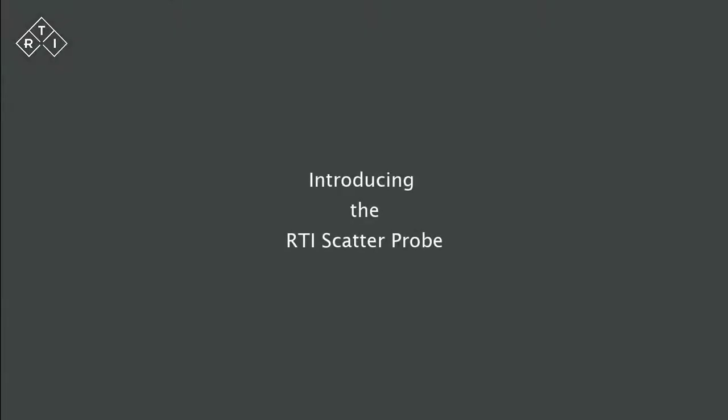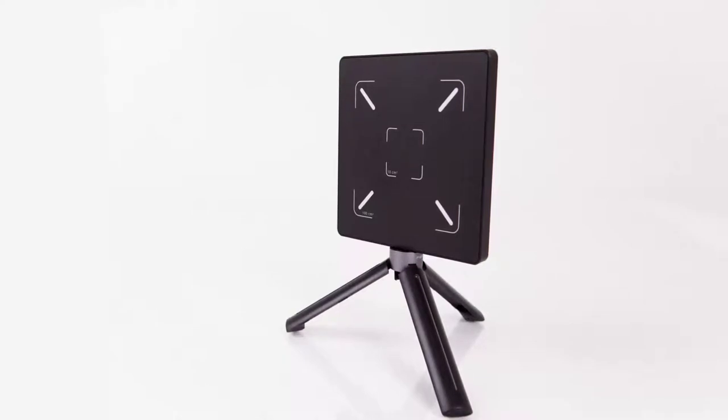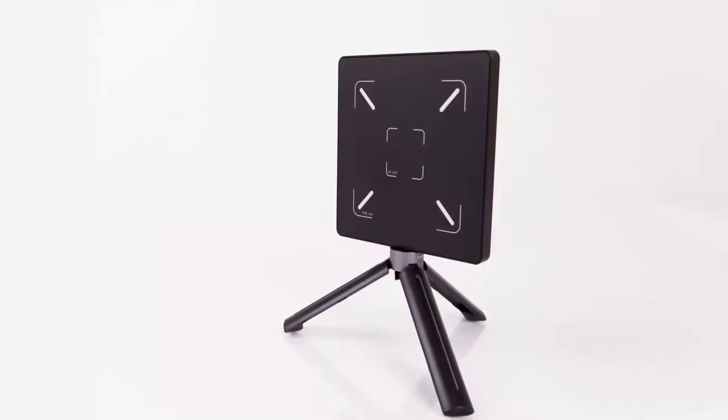Welcome to this introduction to the RTI Scatter Probe. During this presentation, we will make you familiar with the RTI Scatter Probe and look at the most common areas of application, the measurement of X-ray scatter and leakage.